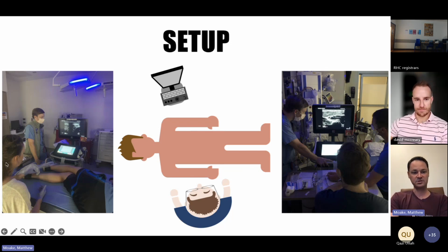This is one of my fellows doing a block on my posterior tibial where we've got the machine sitting here. I'm positioned sort of on my side and she's got the probe and all of her vision is able to sit right through there. And similarly, one of my fellows blocking my forearm, again, a clean line of sight from their body, the area they're blocking, and then the machine, all in one big view.